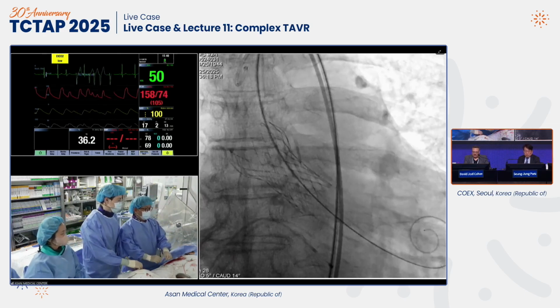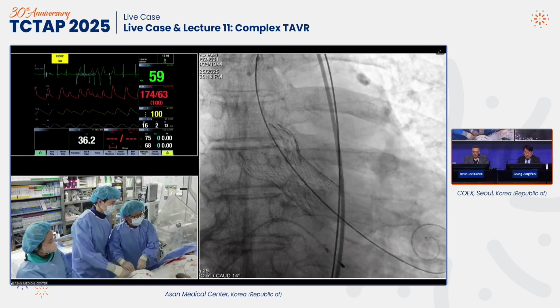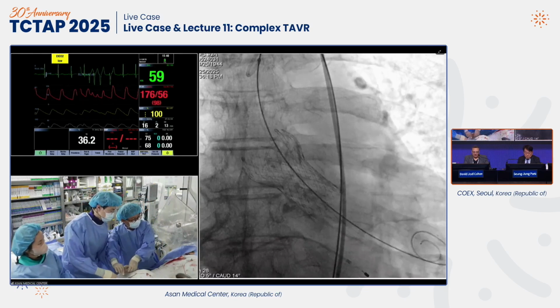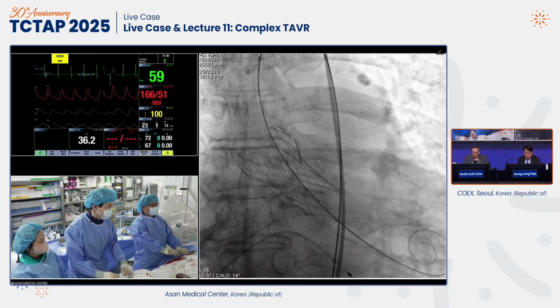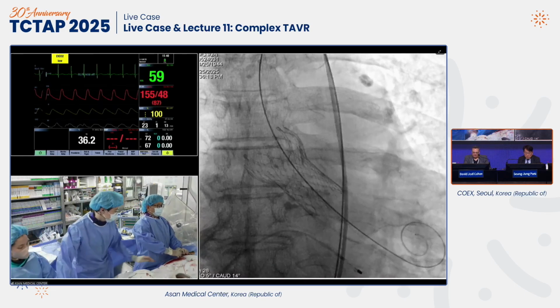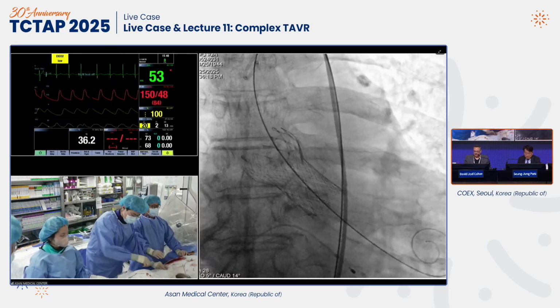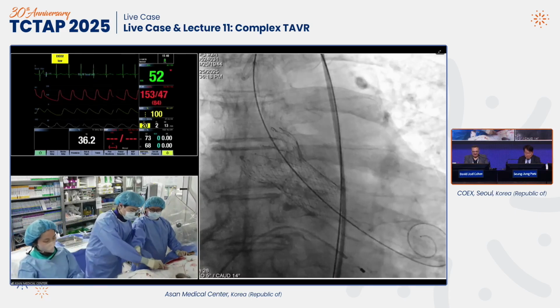Sometimes in really tough cases of these, we've had to go antegrade. We've had to do a transseptal and snare the wire, which is your final secret weapon. I don't like to do that during a live demonstration. I'm glad you were able to cross. Correct.